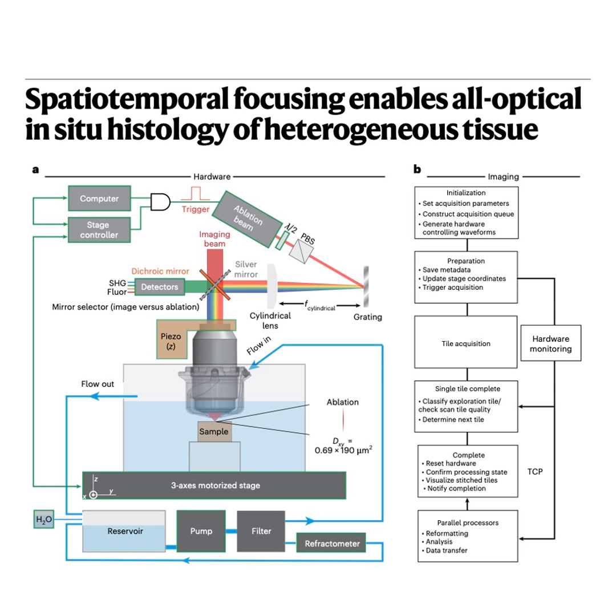But that brings up another potential stability nightmare, doesn't it? The fluid itself, the immersion medium. If you're running this for days, maybe 96 hours as mentioned, surely things like evaporation start to matter. Doesn't the composition of the fluid change? You've hit on one of the most critical and honestly one of the most brilliant parts of the robotic control system they developed. Yes, the immersion medium is crucial, and maintaining its properties is paramount.